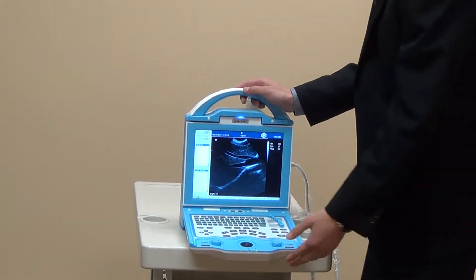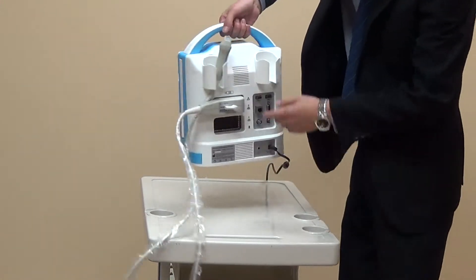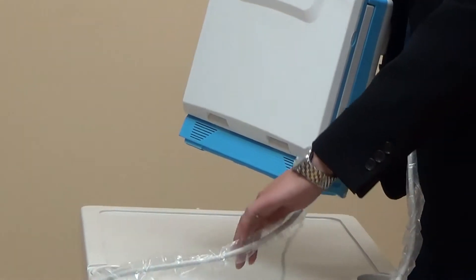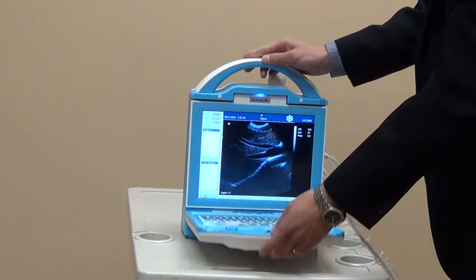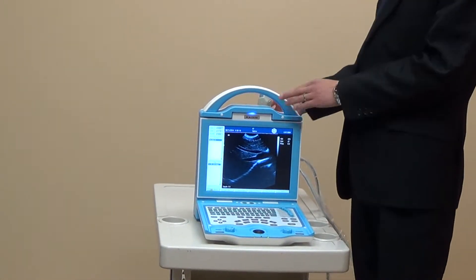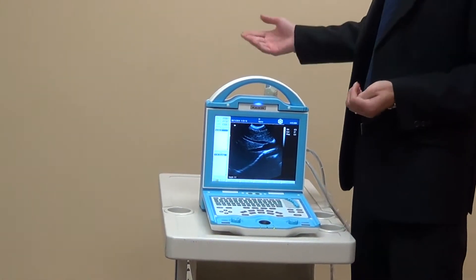Another very important point is that there are two probe sockets — one and two — included as standard. So when you work with small animals, you can connect two probes at once. You do not need to take off one probe and connect another, which is not convenient. This one comes with two probe sockets as standard. This is very important.